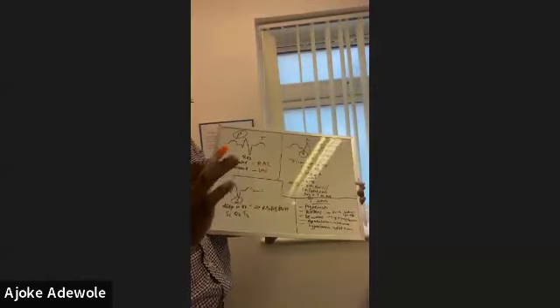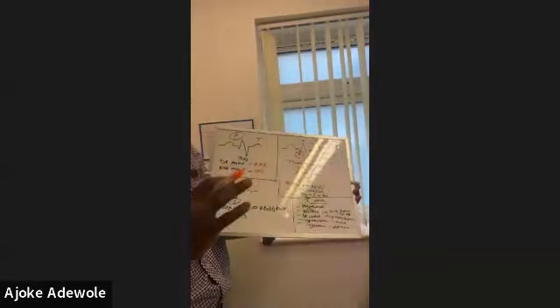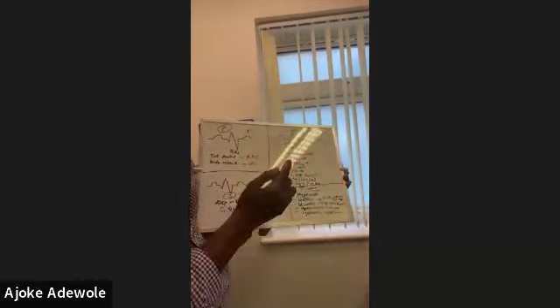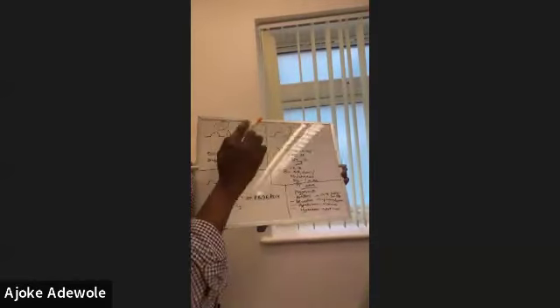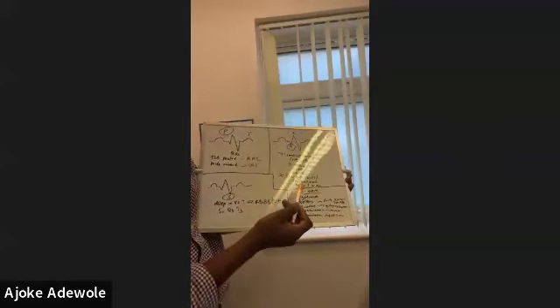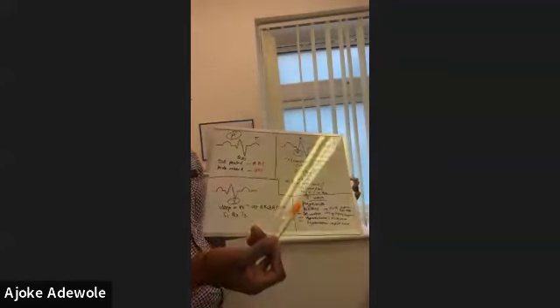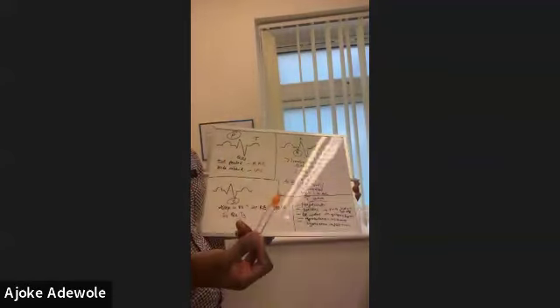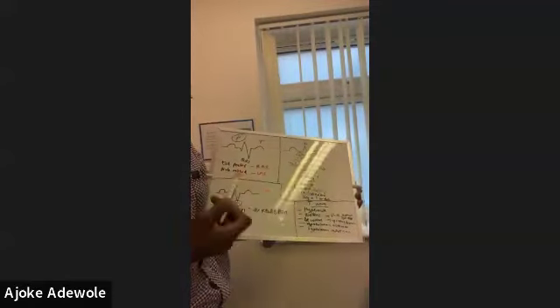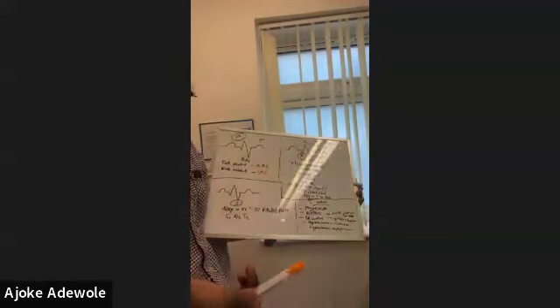So this is the basics of any ECG. There are some normal waves. You have the P wave, you have a Q wave, you have, oh, I've not talked about an R wave, yes. There is the R wave as well, and then there's the S wave and the T wave. But in another section, I can be talking about the J wave, the U wave, and other types of waves that you will find, but not necessarily in a normal ECG. But those other waves will help you know when an ECG is normal or abnormal.